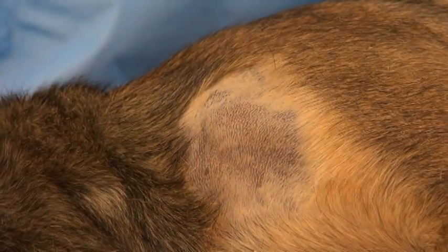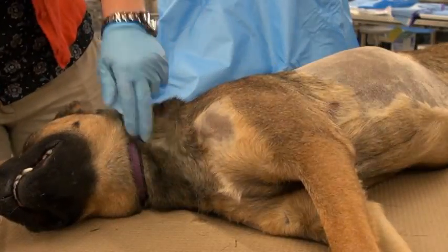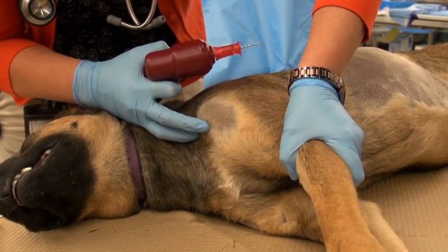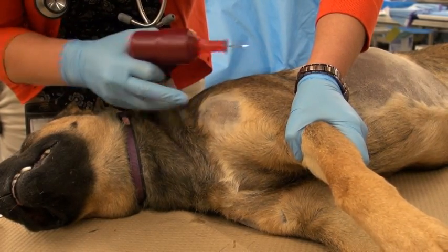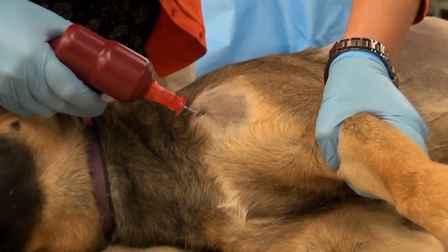A stab incision is made at the desired point of insertion. Then the device is armed with the needle and stylet to drill, the bone repalpated, and the needle is entered through the skin wound previously made.